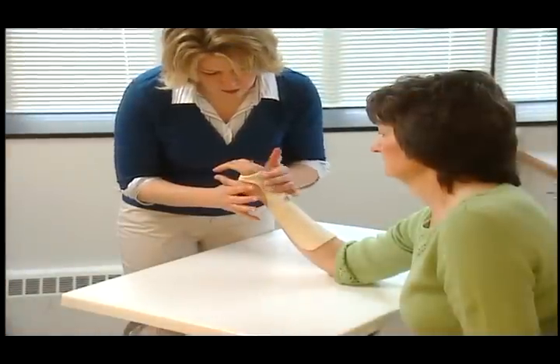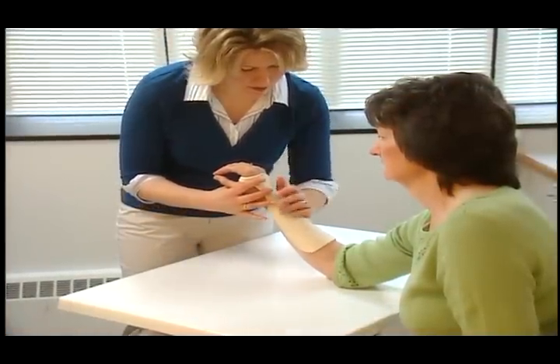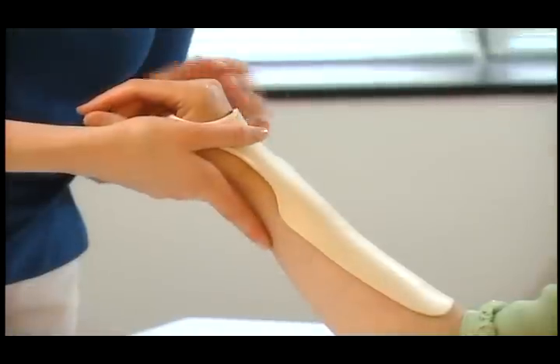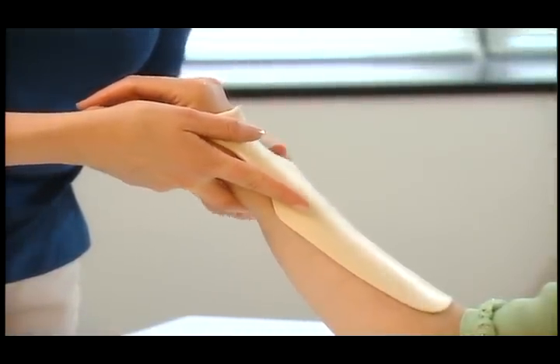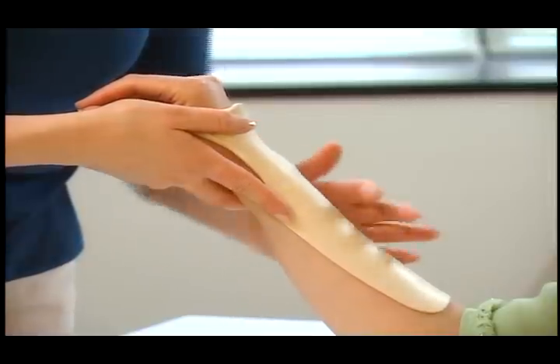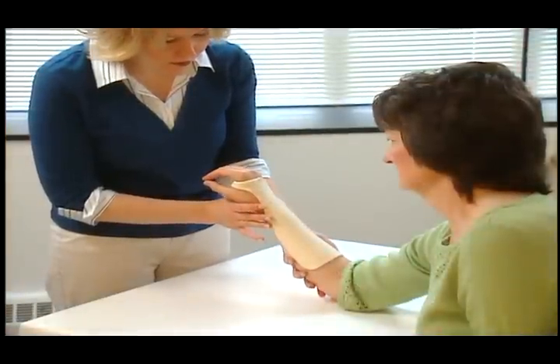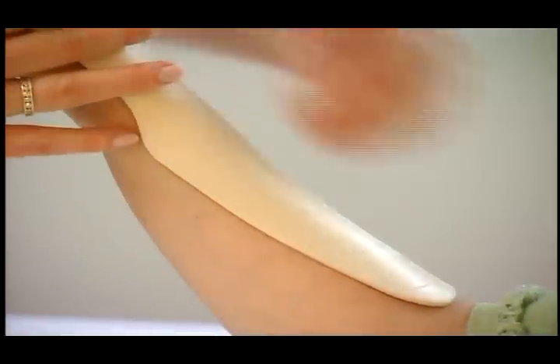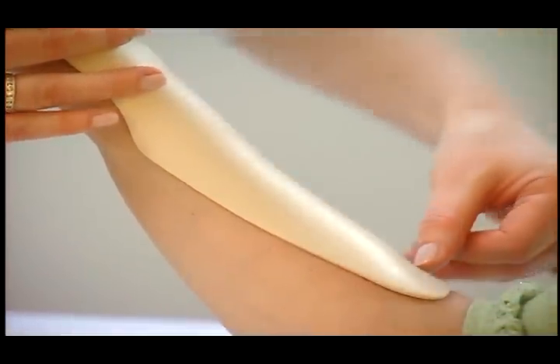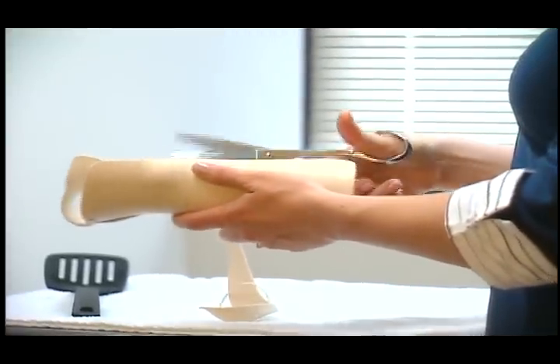It is also important to watch for pressure areas on bony prominences, such as the ulnar styloid. You may want to place a small piece of foam or putty over the prominence before splinting. Another option is to push the material out as the splint is cooling to create more space over the bony prominence. While the splint is still on the patient and slightly warm, use your fingernail to mark any edges that will need to be cut away.